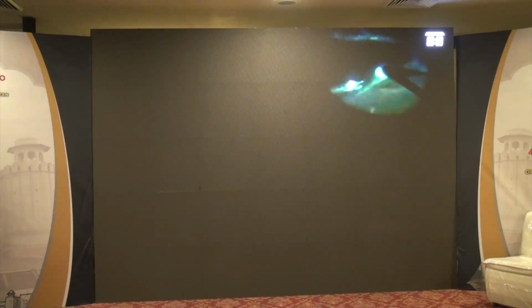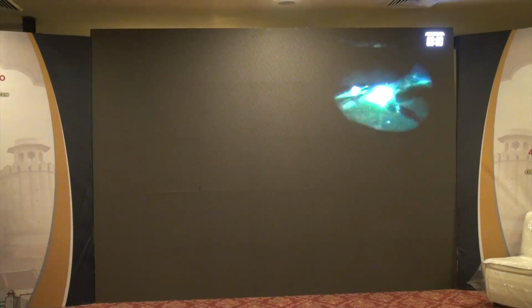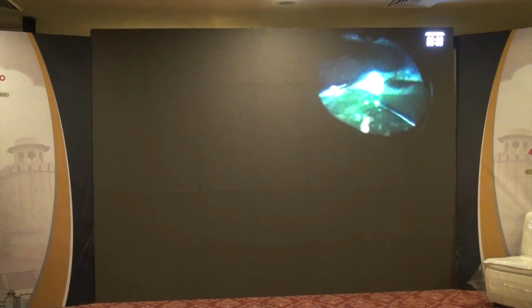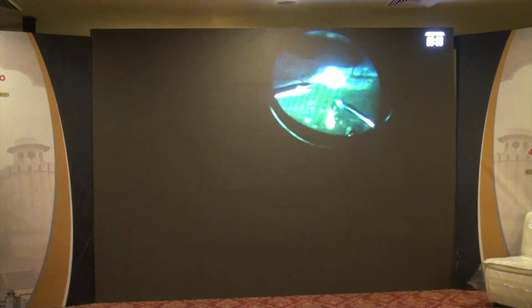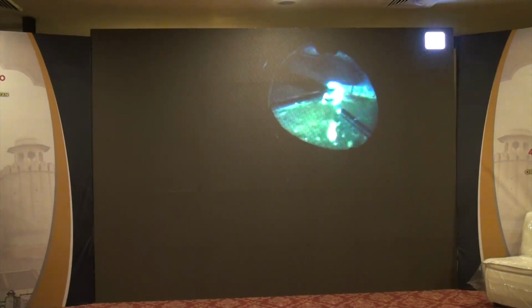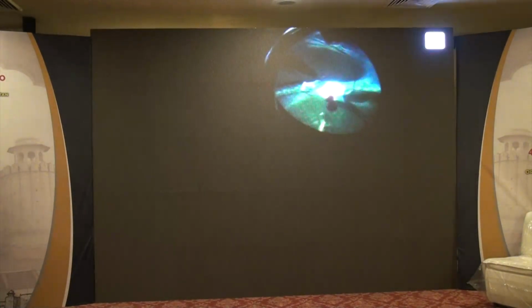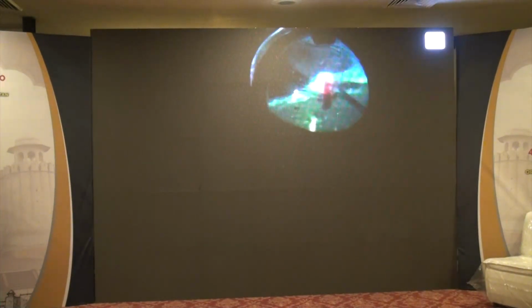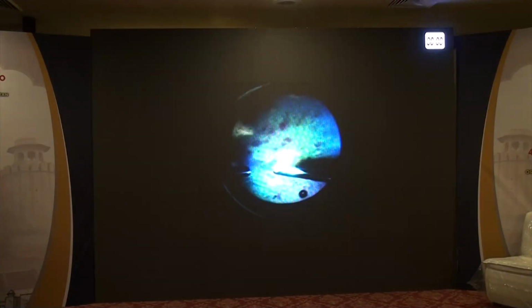At the same time, I've created 3 retinotomies already. Now there are various ways of removing the bands. One is the spaghetti technique where you do bimanual removal. You make two retinotomies at either ends of the band, and using two forceps, you try to disengage the bands from the undersurface of the retina.